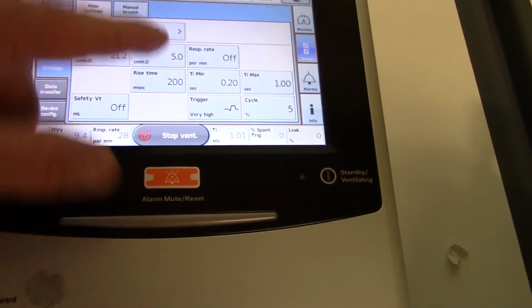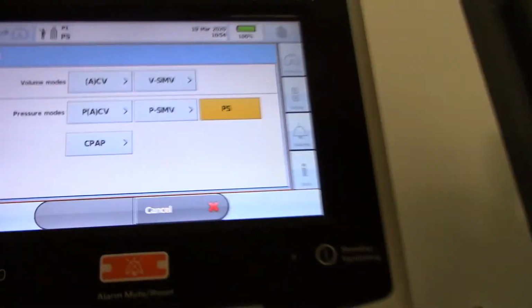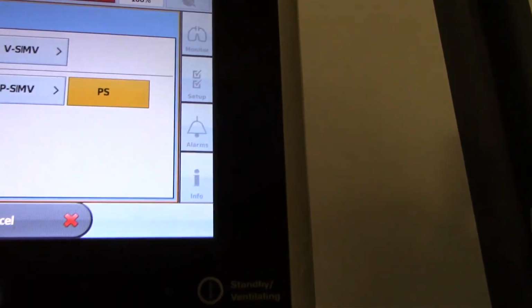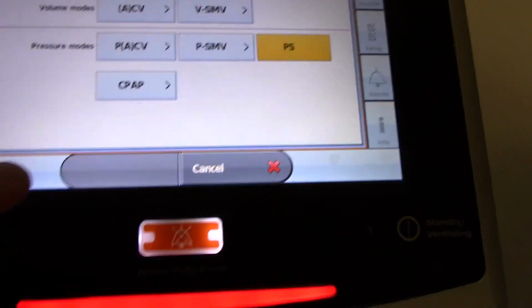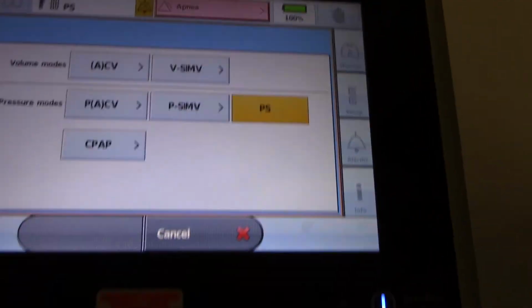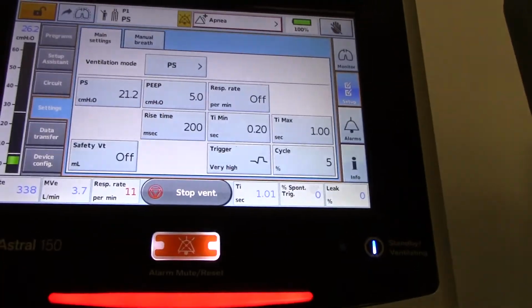Now, those are the only two modes we're going to use: this PSIMV, which is equivalent to SIMV pressure control, pressure support, or the PS, which is CPAP pressure support. We're not going to use this PACV. We're not going to use any of the volume modes at the top. Those are the only two modes we're going to suggest that this vent will be able to replicate for the servo itself.